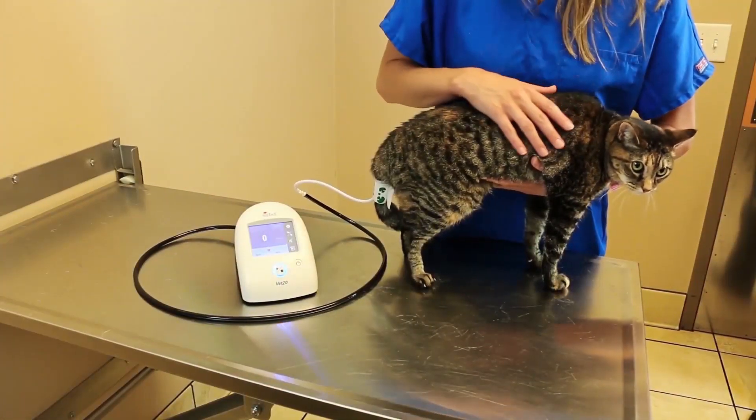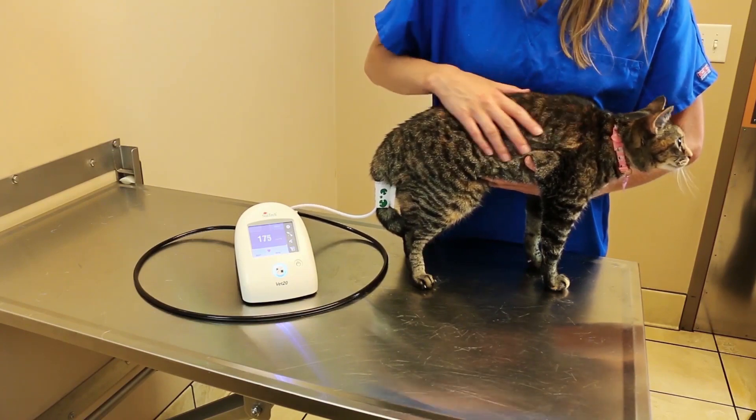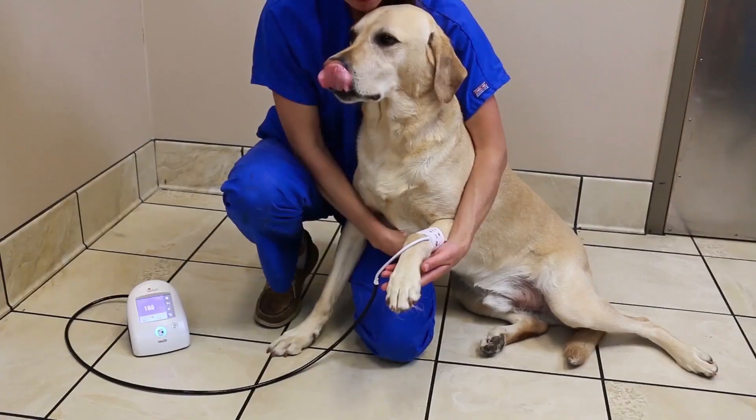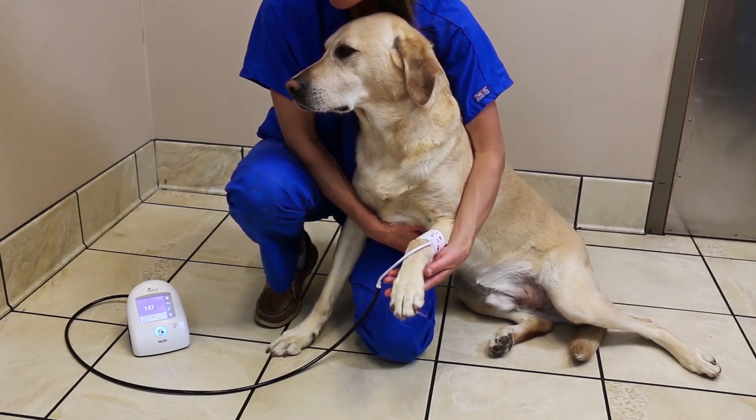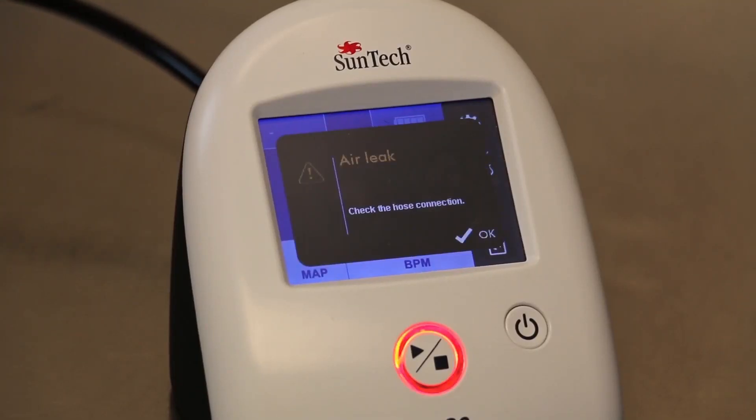You can also take a BP measurement with the patient standing, but the cuff will need to be on the tail. Large dogs can either lie, sit, or stand on the exam floor during a BP measurement.